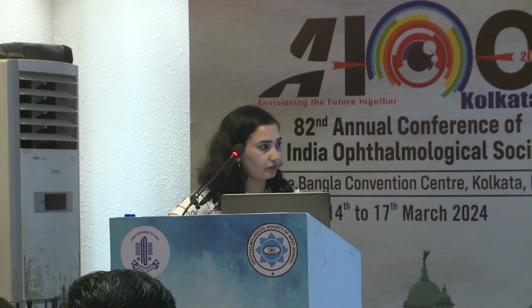Yes, sir. Again, it's not accurate, OCT basically gives a rough idea. Otherwise, when you do the squint surgery, it is the surgeon's own experience, at what level you are cutting and whatever you are suturing. So this is surgeon associated, many factors. Okay.